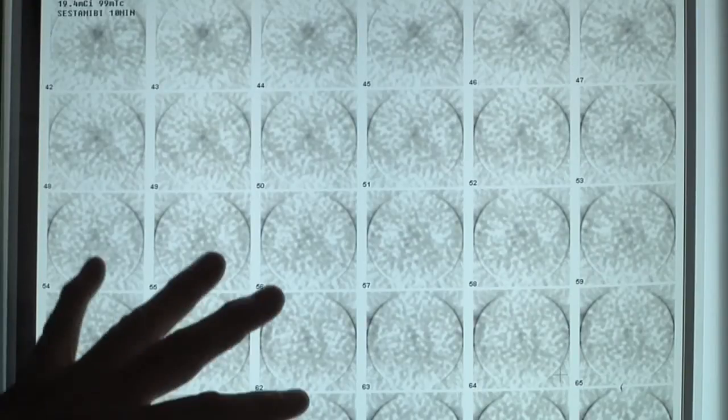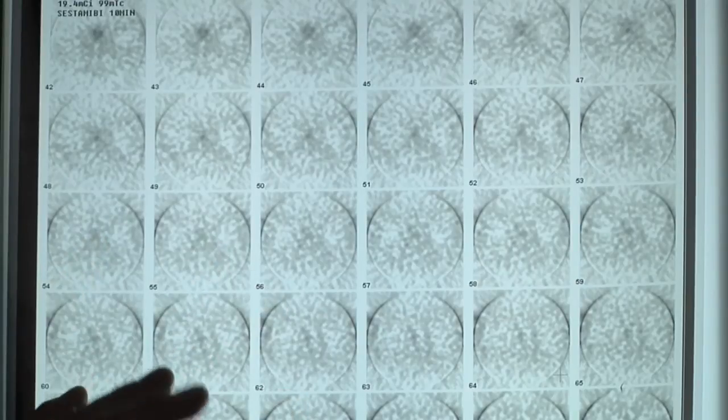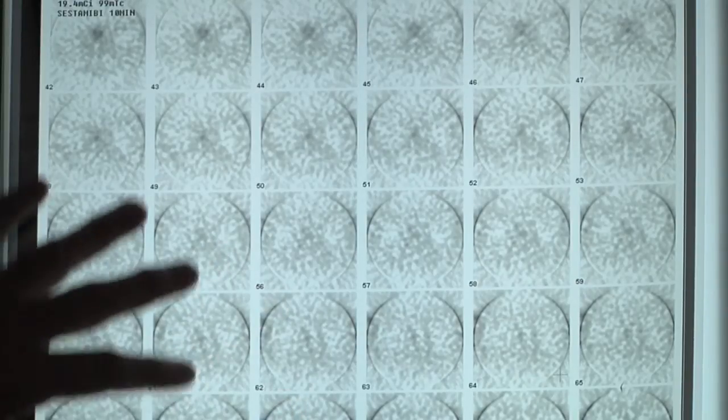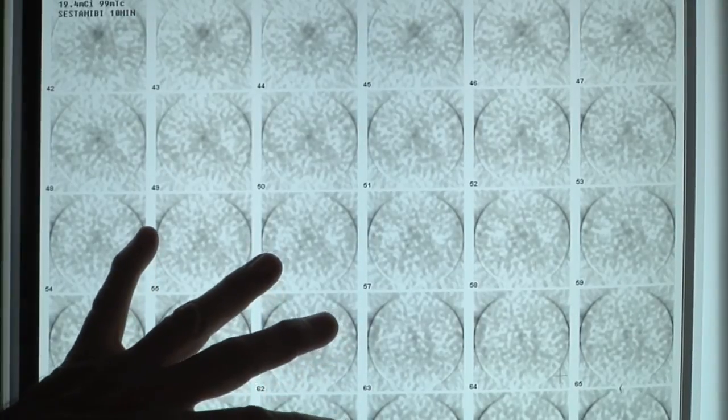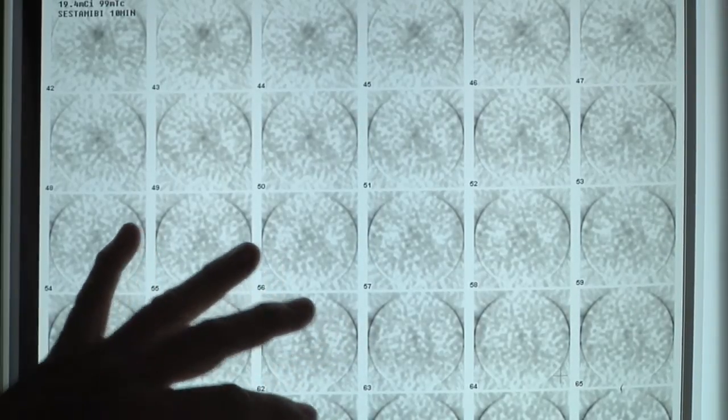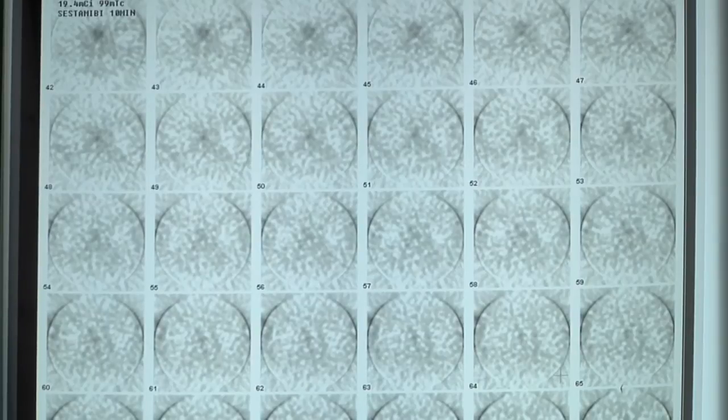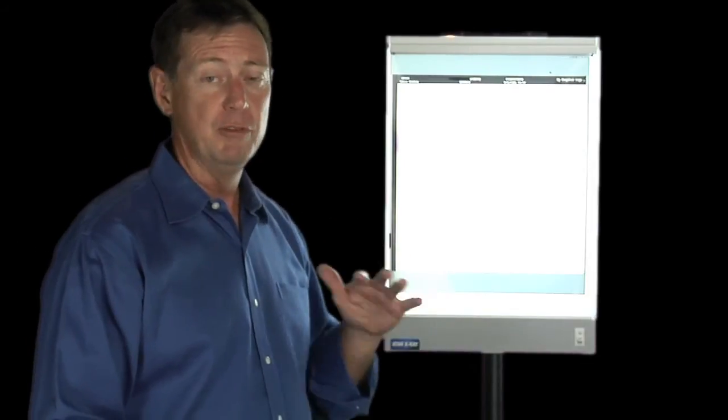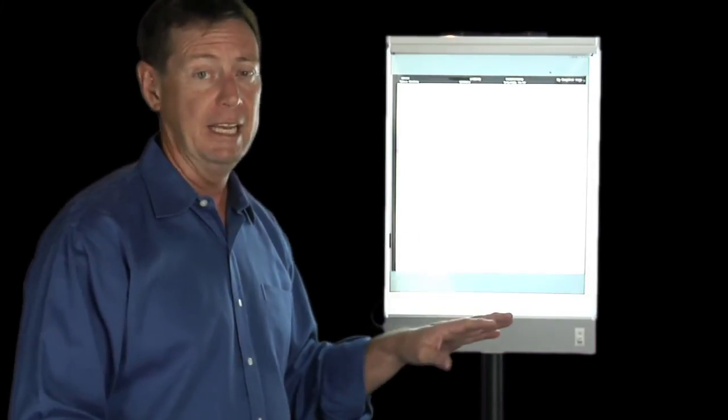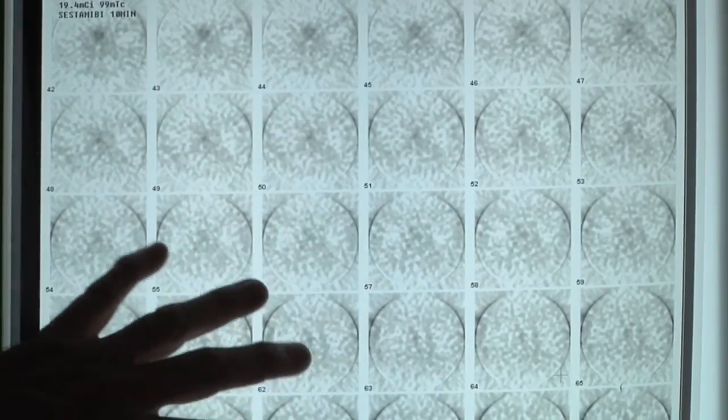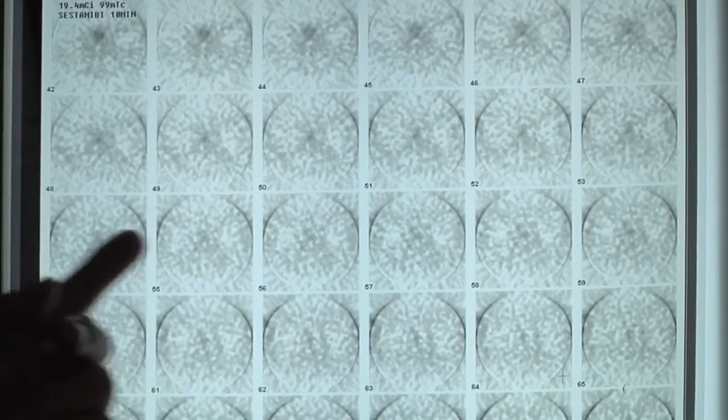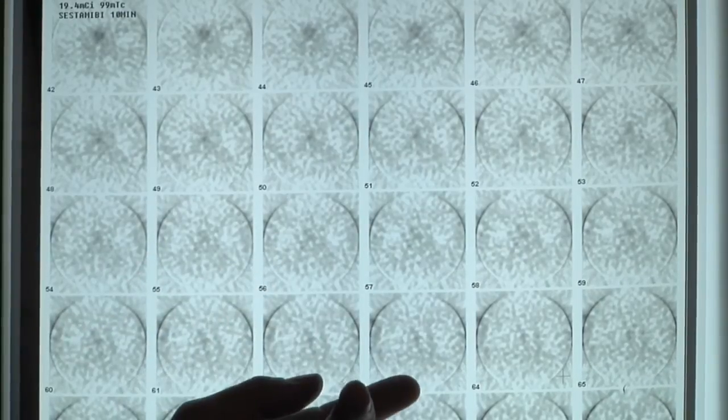This is the third and final example of a Sestamibi scan, what to look for, what not to look for. All these blurry pictures are, this is called SPECT scanning, S-P-E-C-T. It's not a very good technique. We never use this technique. It's not good. We gave up on this over a decade ago. As you can see, you've got a series of pictures, all of which are blurry. There's no useful information here.